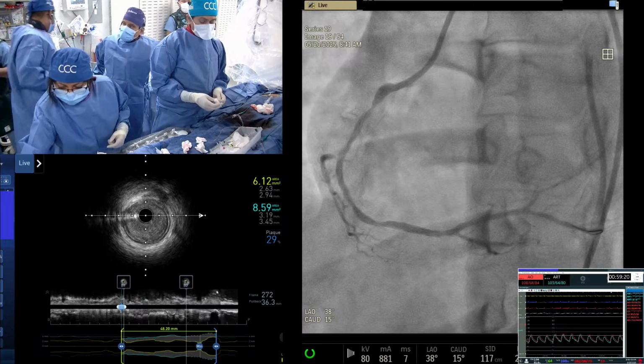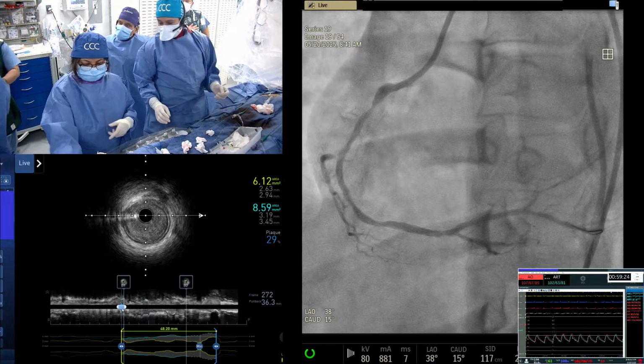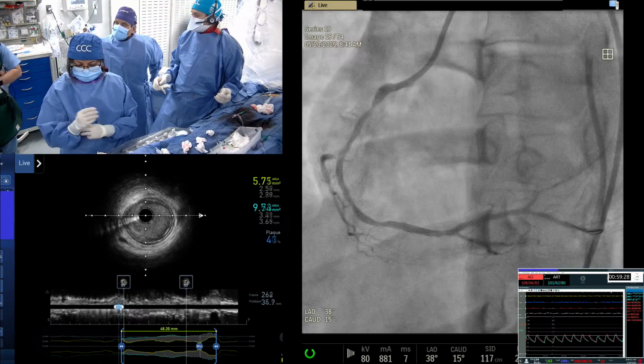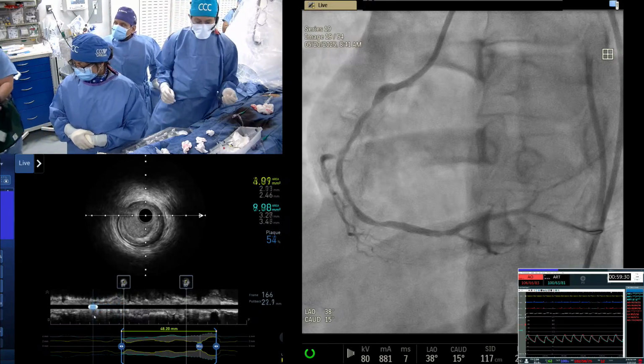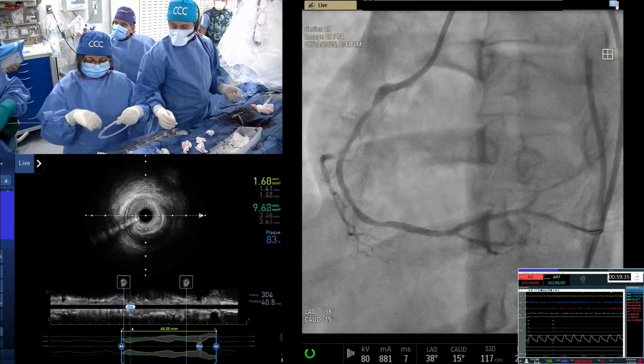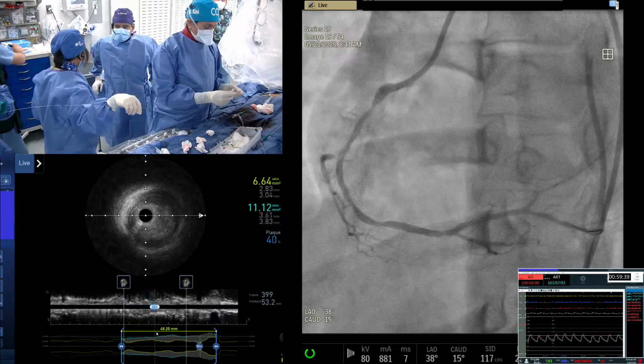Abbott also got the catheters. You know, the Bolt Medical Fracture has been taken up by Boston Scientific. So Abbott has another IVL catheter. Every company is coming with an IVL catheter, and Javelin is for our usual Shockwave. The peripheral trials are ongoing here, but coronary we're not.